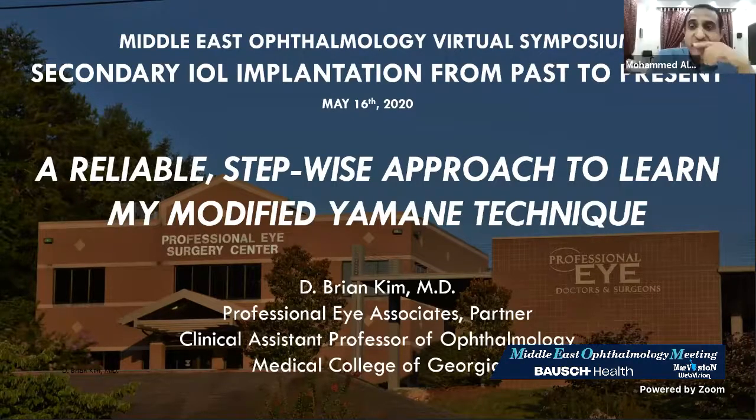Okay. There is a comment: the 2 millimeter tunnel is made blindly through the sclera. Depending on experience, how deep are you going to be in the tunnel?